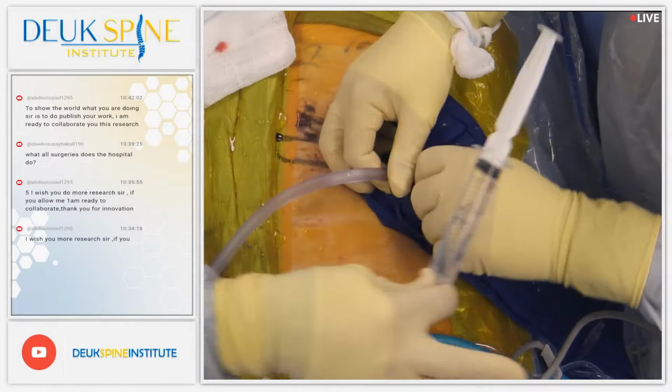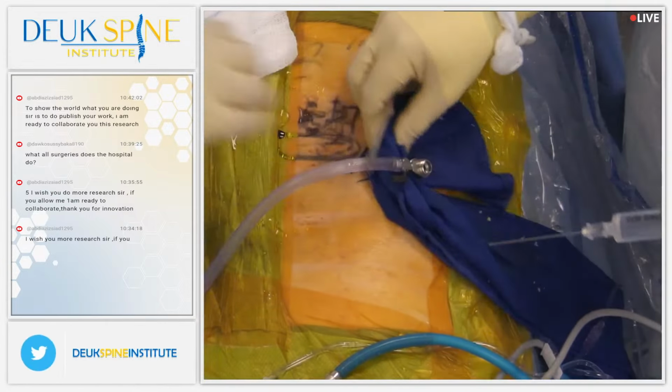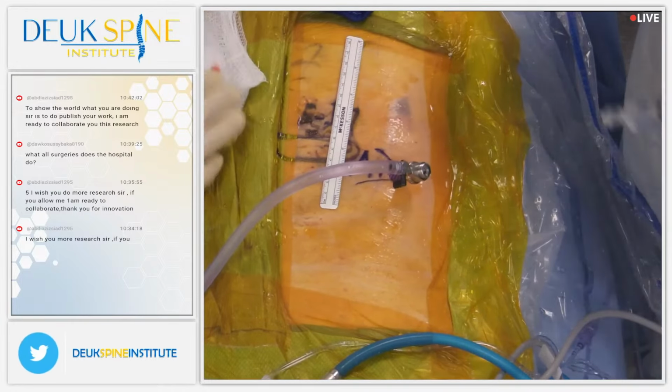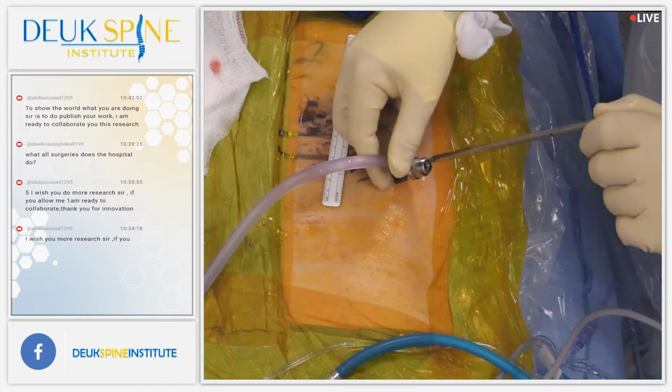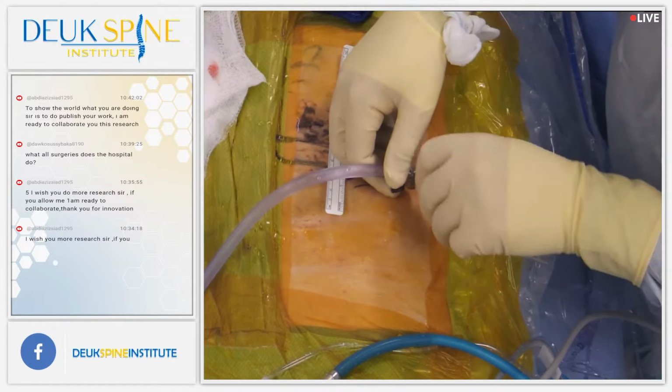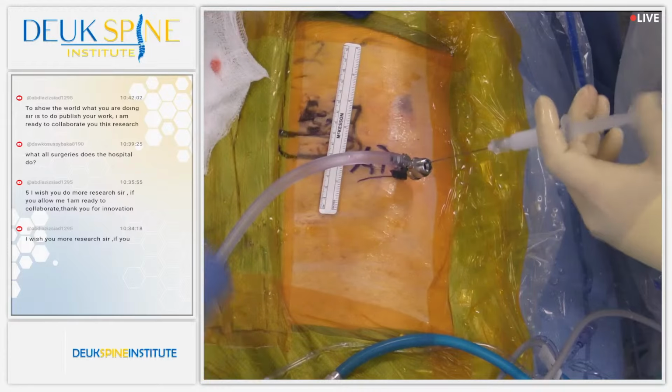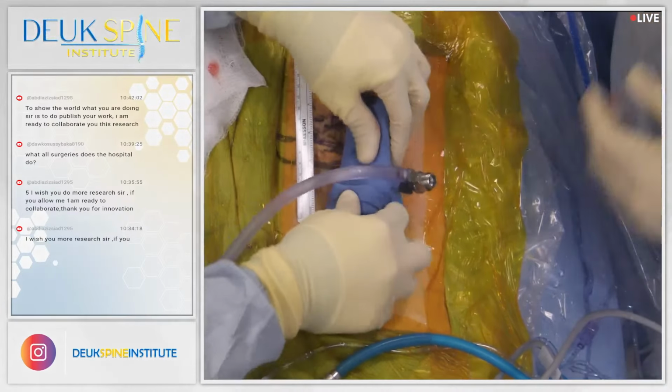No current questions. All right, let me show you folks the incision. It's tiny. Our incision is just 7 millimeters, 1/4 inch. And this patient's going to go home in 30 minutes. It's outpatient surgery.